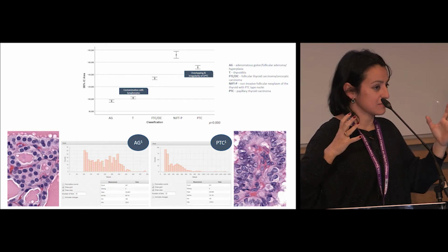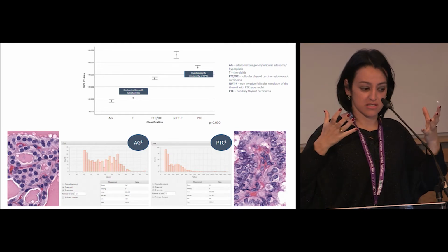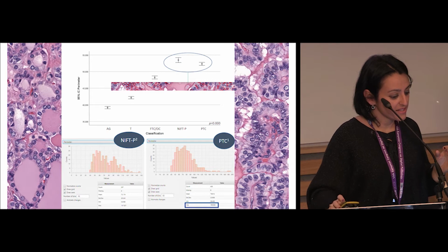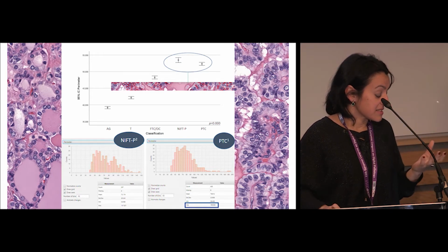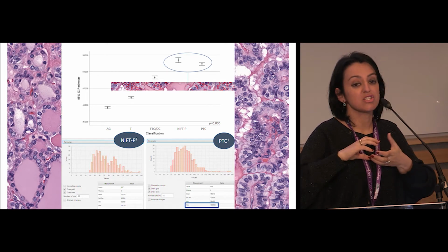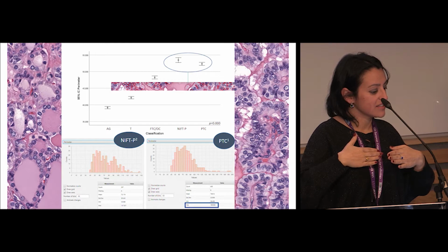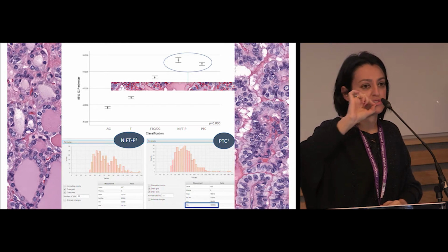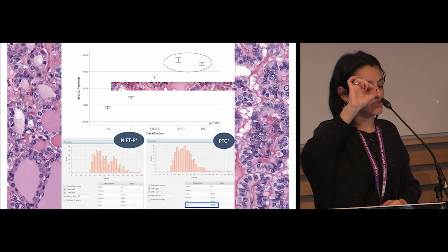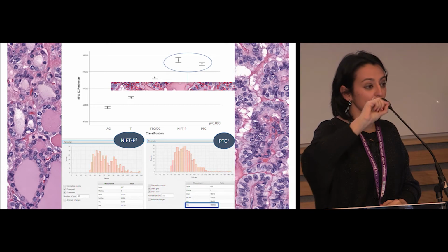By our eyes, I mean. So I'm trying to compare what we have as a concept. And this, I believe I can explain by the same problem that I found in the examination of the perimeter. Because these nuclei are very irregular and very overlapping, when I see the contours of the nuclei that the program makes selecting the nuclei, they are not complete. They're not all around.